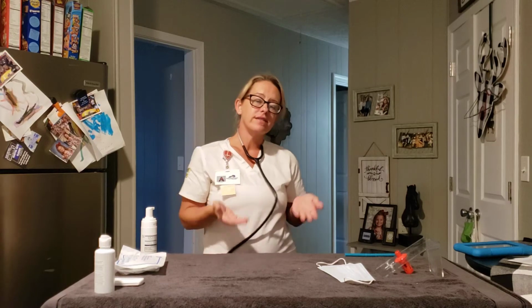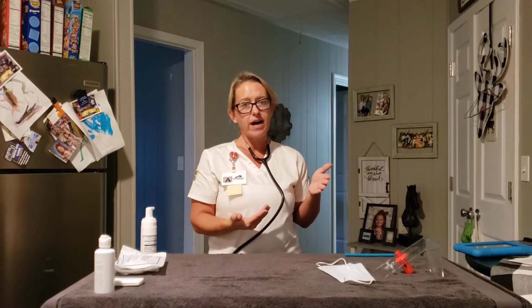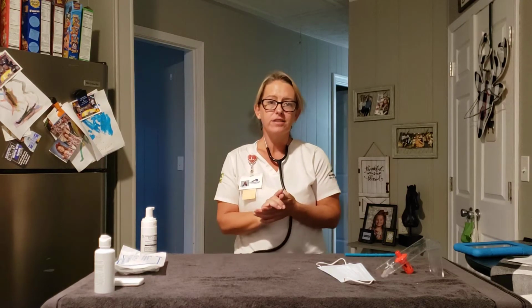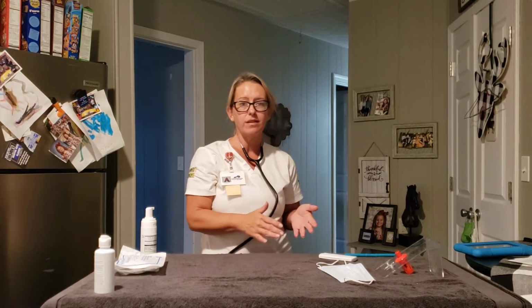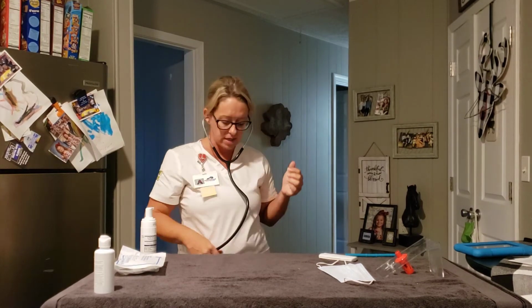So I'm going to go ahead and raise the bed to a good body mechanic. I'm going to put the patient in a high Fowler or semi-Fowler position. I'm going to go ahead and start the assessment by checking her O2 so I know what it's running right now because it's been low. And then I'm going to go ahead and listen to her breath sounds or her lung sounds.